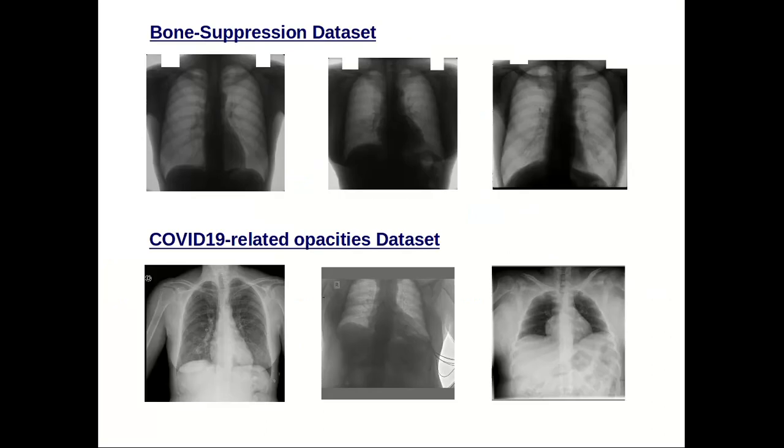Now, as I already mentioned, we must bear in mind that the bone removal training dataset is not the one we really care about here. It is just a preprocessing tool for us, and the fact that it is completely different from our target dataset could impose a problem. While the bone removal training dataset is composed of high-quality images in pretty similar conditions, our target dataset is more real-life data. It contains much more diverse qualities, sizes, anterior versus posterior directions, angles of scan, brightness levels, and flipped grayscale color maps. So what we need to do is to worsen the bone removal training dataset in a way that it will get some resemblance to the target dataset.